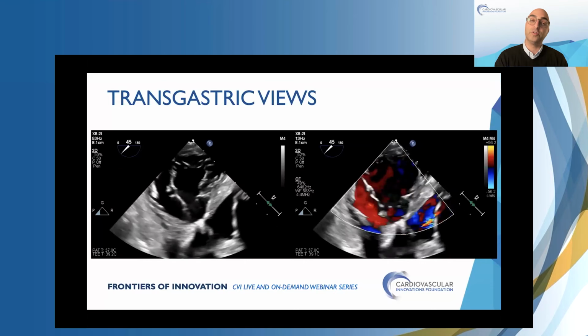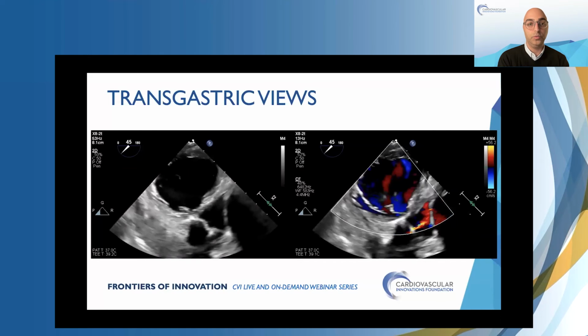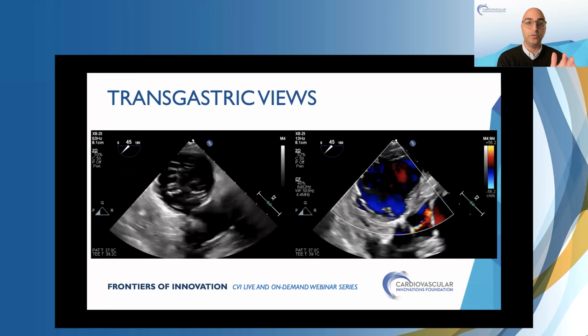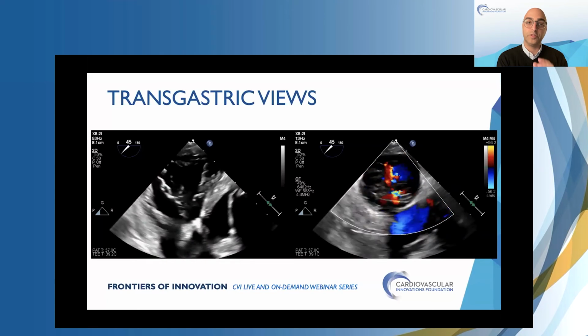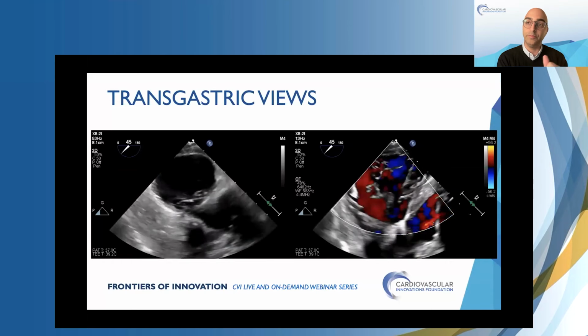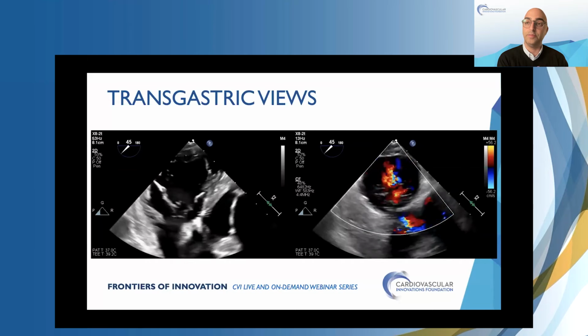You end up seeing more of the ventricle, and as you clockwise rotate your probe, you end up seeing more of the atria. So it's actually at 8 o'clock. It's actually a very small anterior leaflet, which is not usual. And there's 2 large posterior leaflets. And there's a prominent cord. It looks like there's 2 septal leaflets, but I believe when we mapped it out, there was a prominent cord there too, right at that central SA position.